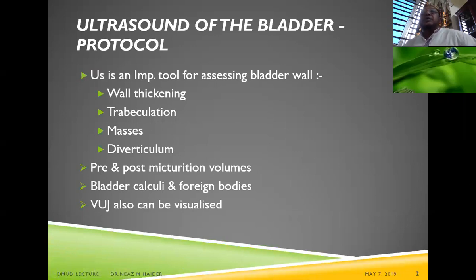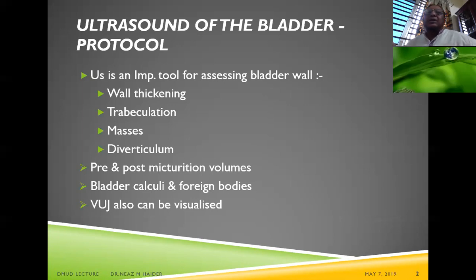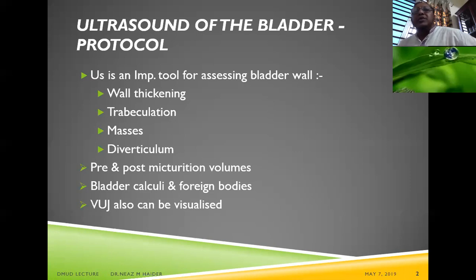We use a standard protocol for ultrasound of the urinary bladder. It is an important tool for assessing the bladder wall — we can look for wall thickening, assess trabeculation, and diagnose masses, calculi, or foreign bodies within the urinary bladder. We can also assess pre- and post-micturition volumes and examine the surroundings, including small calculi in the ureter or diverticula.